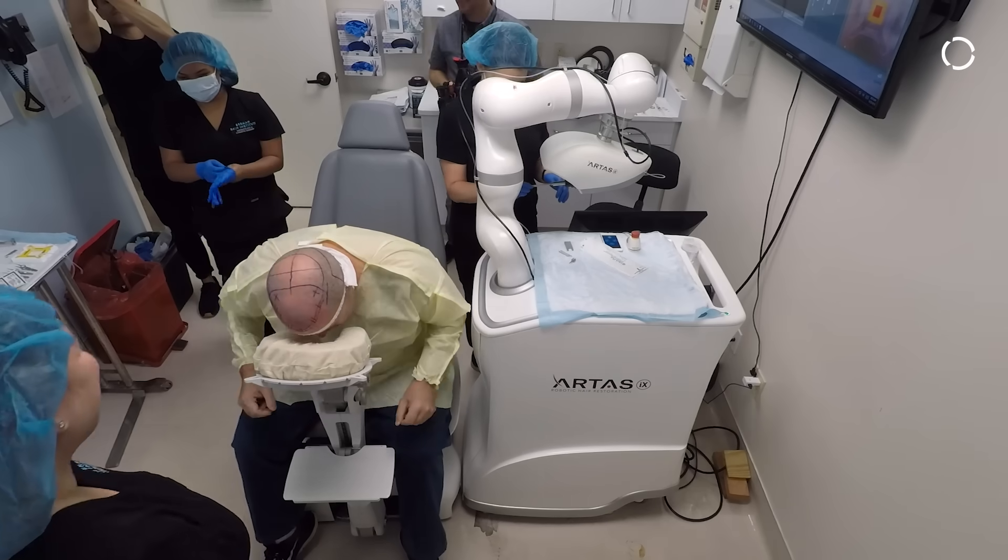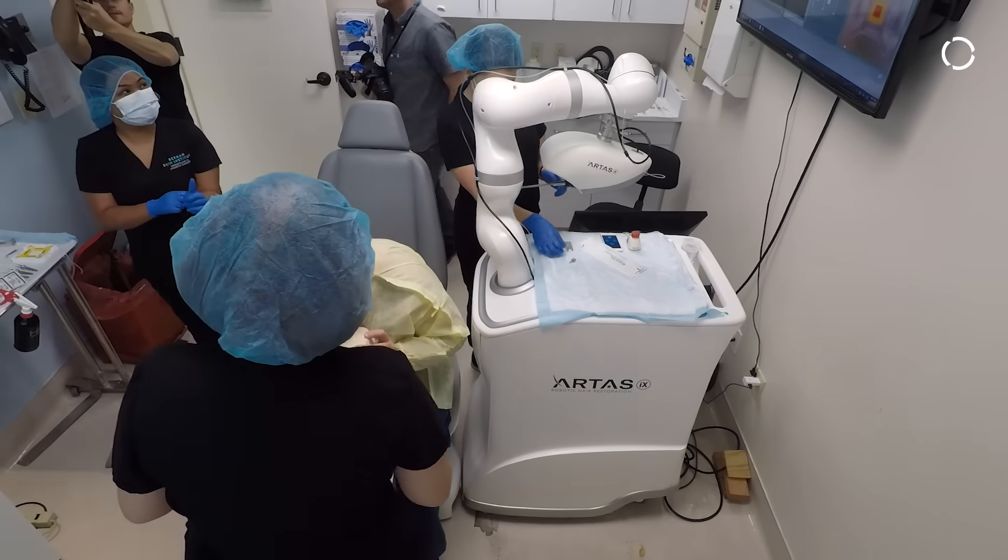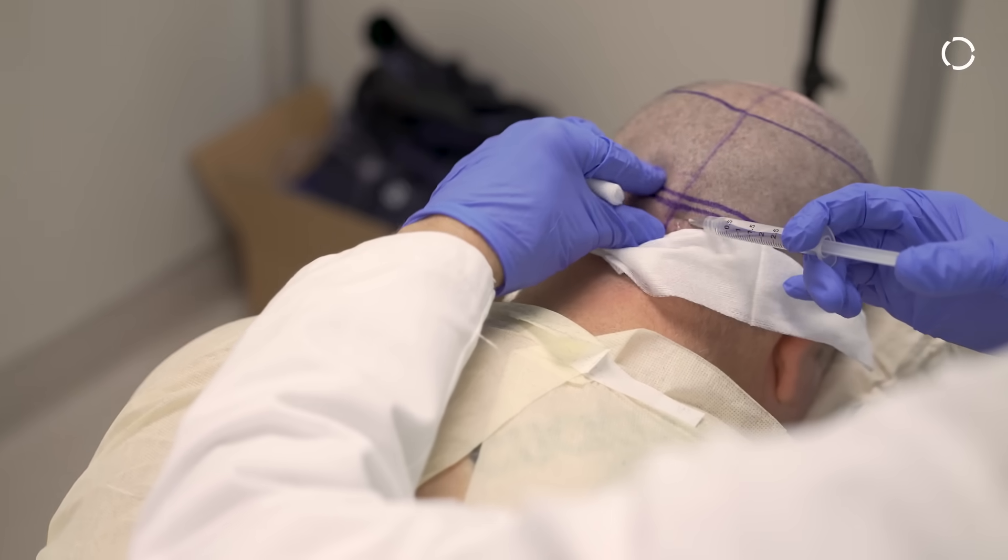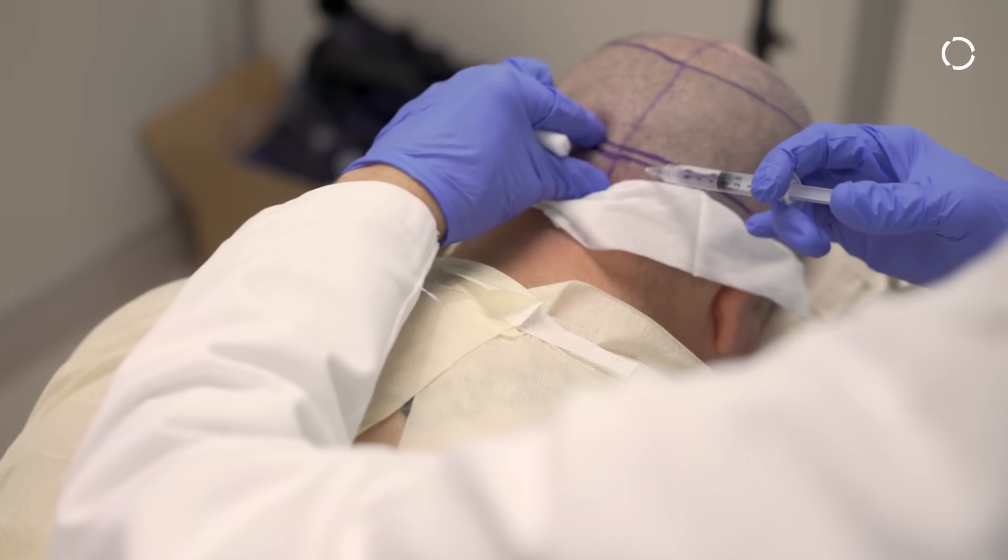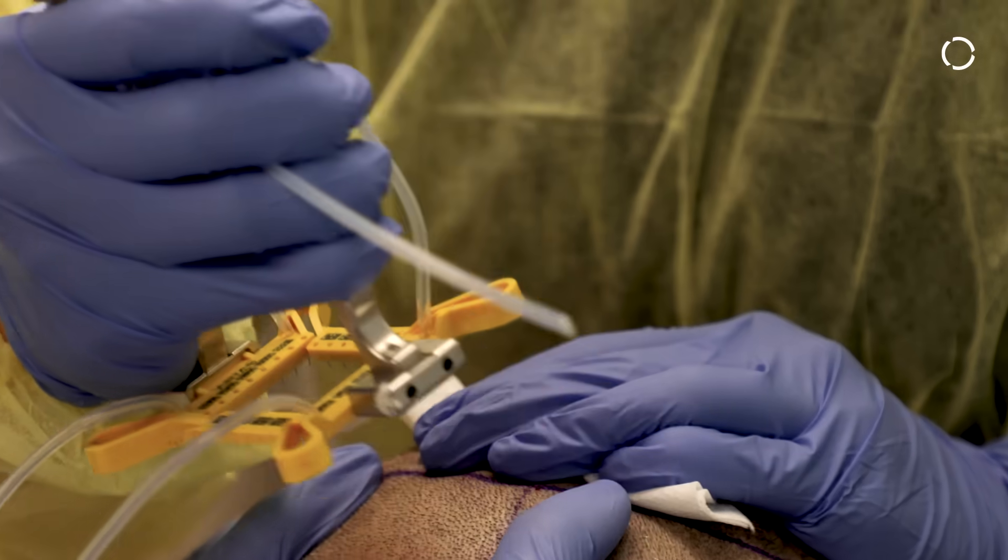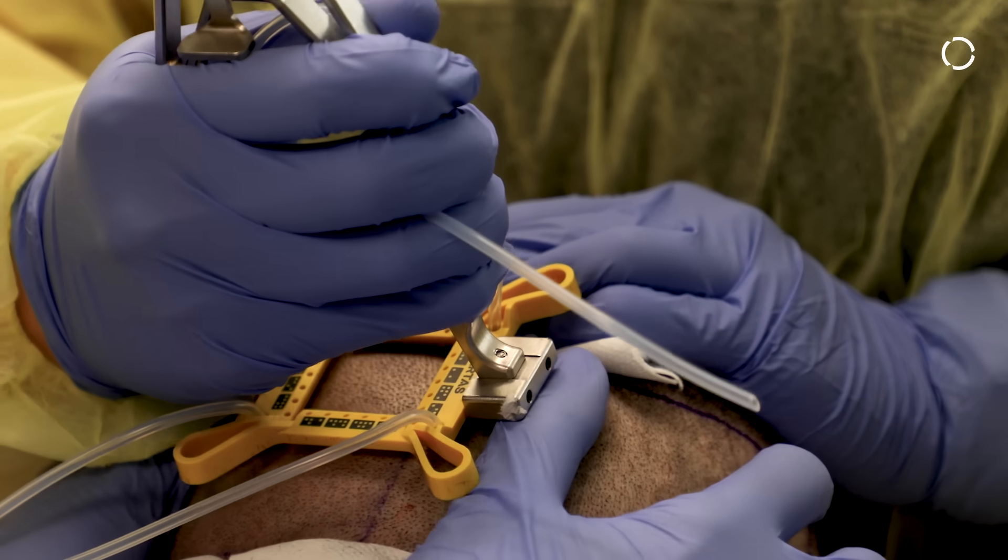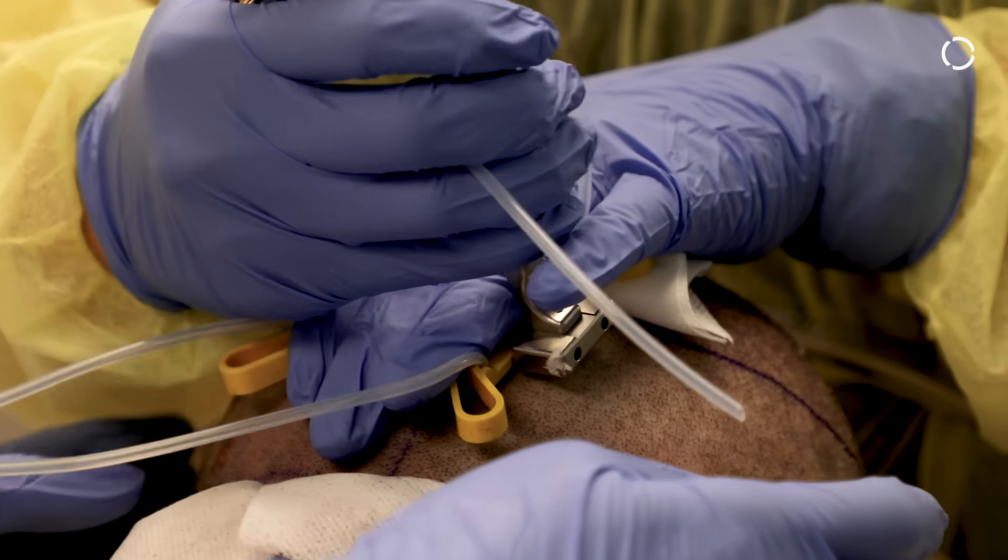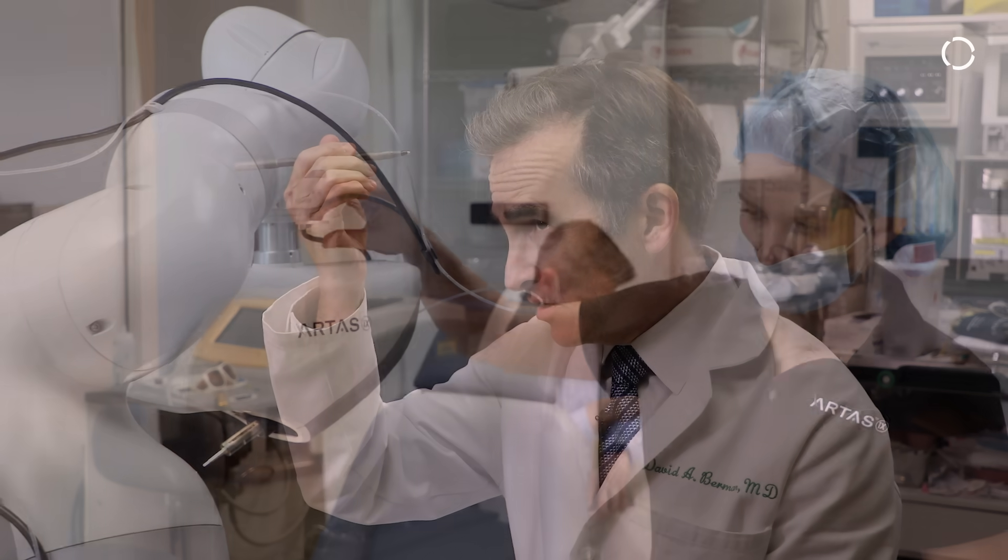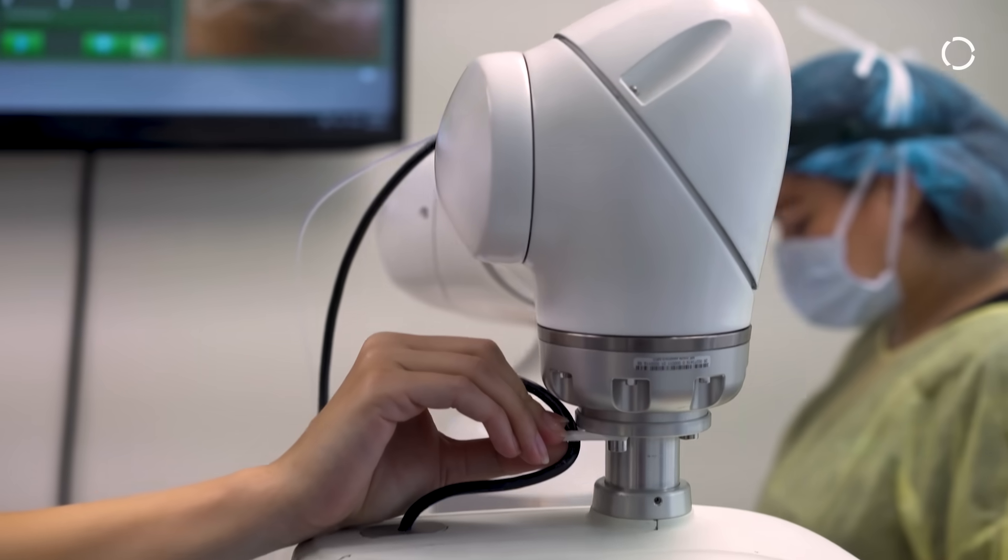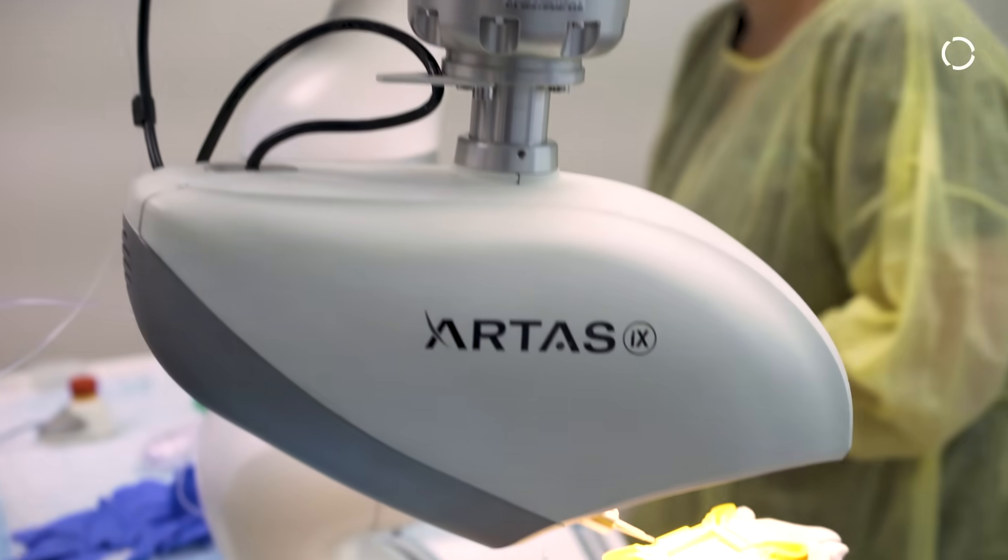It's a procedure that allows us to harvest from the back of the scalp without a linear scar. So instead of the old FUT or strip procedure, we're using the robot to take a smaller than one millimeter punch device to punch out these little tiny grafts that contain one to three hairs, on average 2.2 hairs per graft. After we take those out, we can also with the robot make incisions, and now with the latest system we can actually implant using the robot.